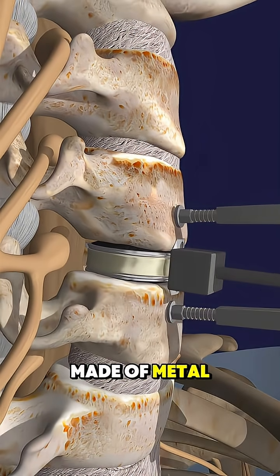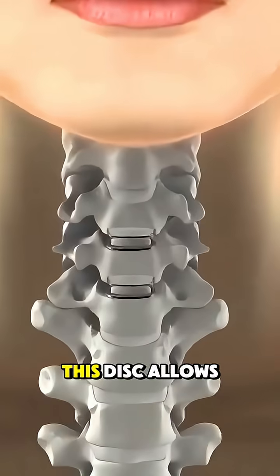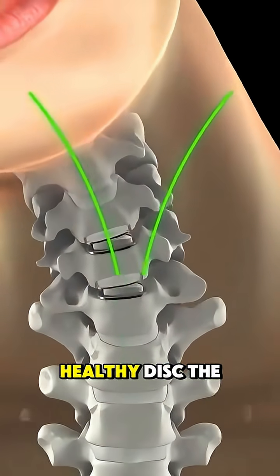Then, an artificial disc, made of metal and plastic, is placed in the empty space. This disc allows normal movement, just like a healthy disc.